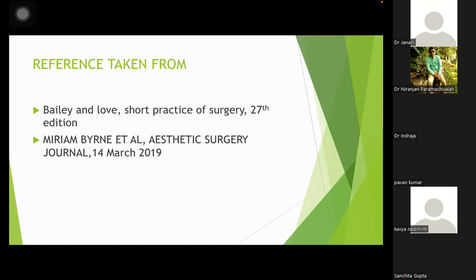Every suture has to be visualized, especially in the corners, because they are called the corners of sorrow, because the leak happens most of the time at the corners, especially on the mesenteric side. So you have to make sure your technique is good. Even the best anastomosis can still leak, but it should not be due to technical reasons. That is what you have to learn.